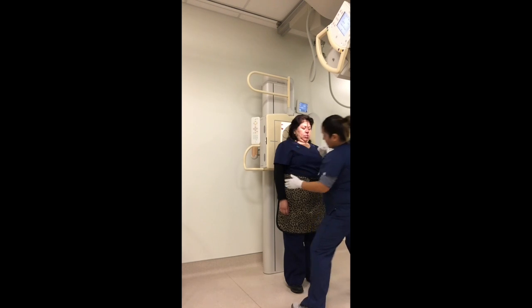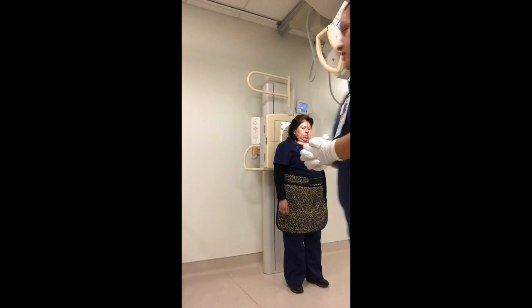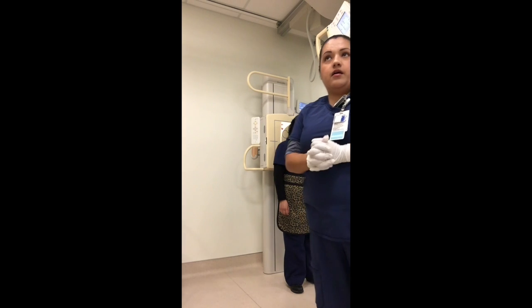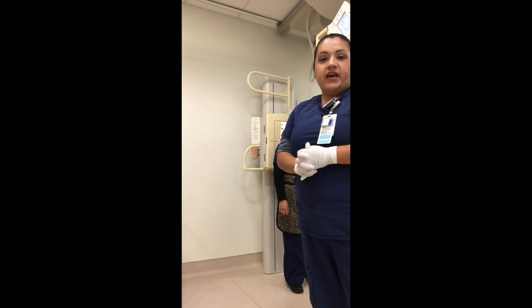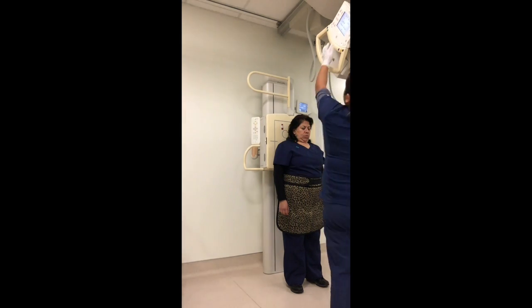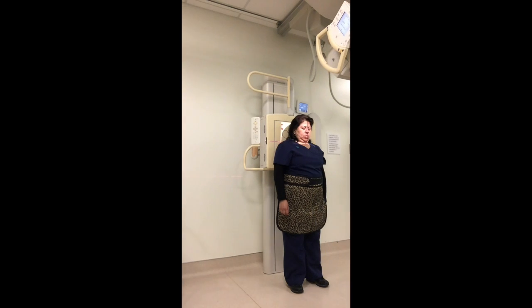Okay. So Ms. Rodriguez, before I give you these breathing instructions, the technique I would use would be the same as for my Caldwell. So I would use 85 kV at 14 mAs. Ms. Rodriguez, go ahead and hold your breath.